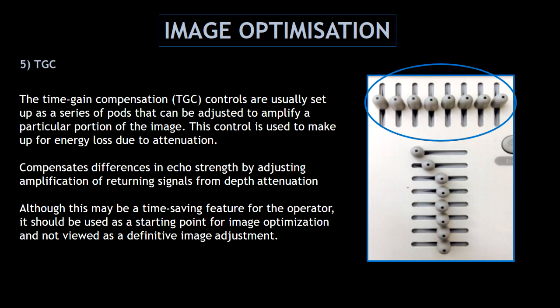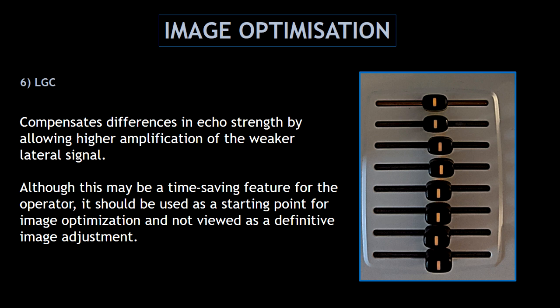Another feature is the TGC. The time gain compensation controls are usually set up as a series of pods that can be adjusted to amplify a particular portion of the image. This control is used to make up for energy loss due to attenuation. We can also adjust the LGC, lateral gain compensation, which compensates differences in echo strength by allowing higher amplification of the weaker lateral signal. Although TGC and LGC controls might be a time-saving feature, they should be used as a starting point for image optimization and not viewed as a definitive image adjustment.